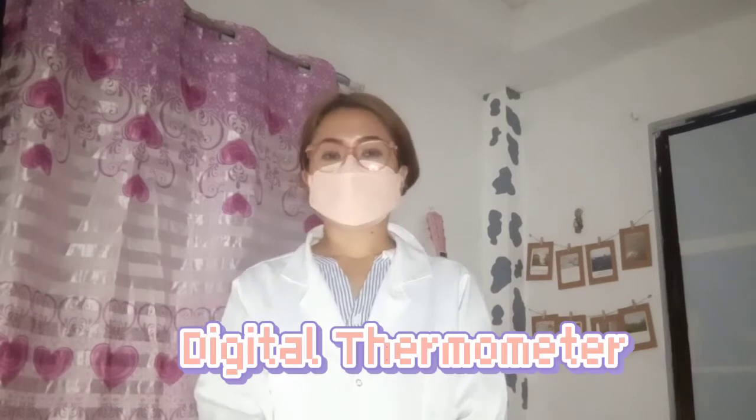Hi, I'm Guaymas Hoover. I would like you to watch a short video that will provide instructions on how to use your digital thermometer properly.